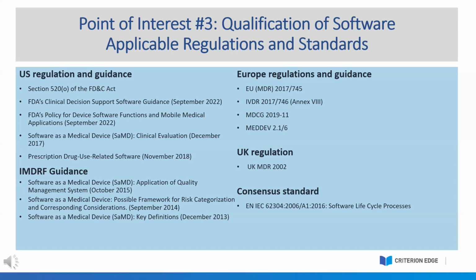And I would say the MDCG 2019-11 guidance is very helpful in deciphering what the expectations are around software for IVDs and for MDs and for mobile applications and so on.